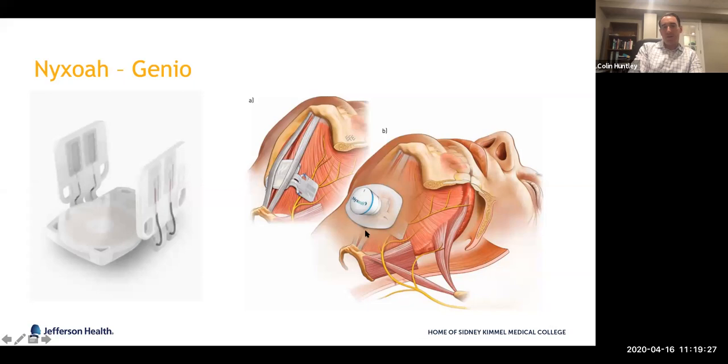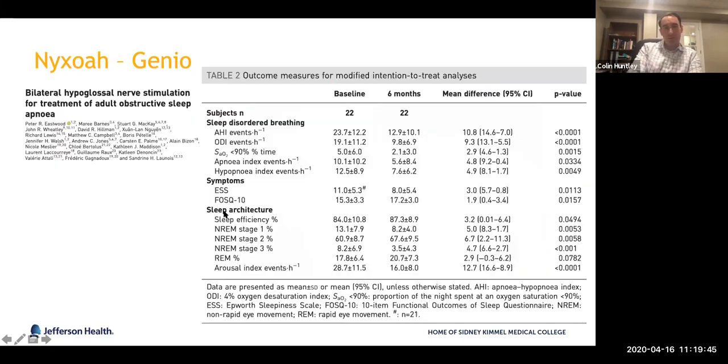And this device, this is actually an adhesive pad, and this device we're able to program, and it communicates and charges the implanted device to allow for stimulation of those distal branches of the nerve at nighttime. Again, no respiratory sensor here, so you see more tonic stimulation.